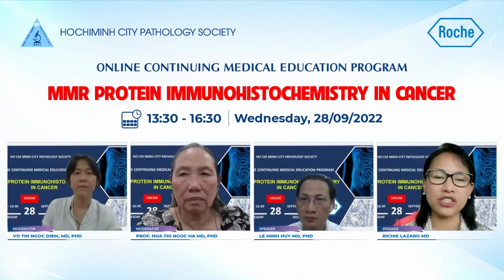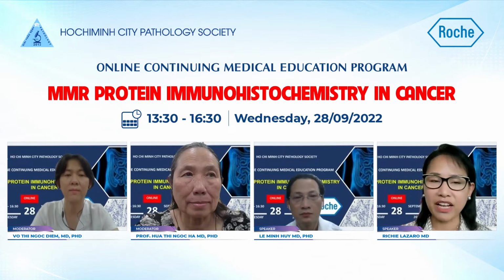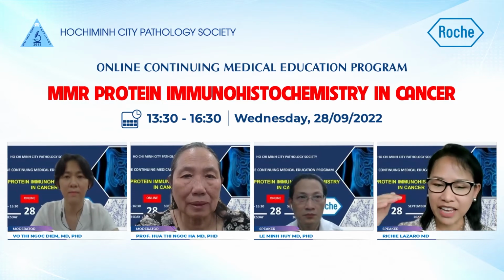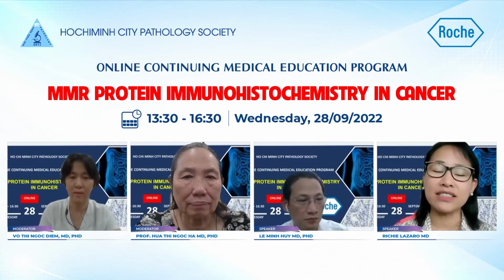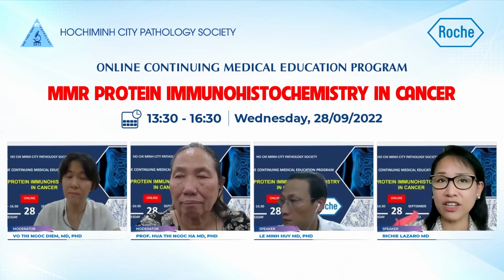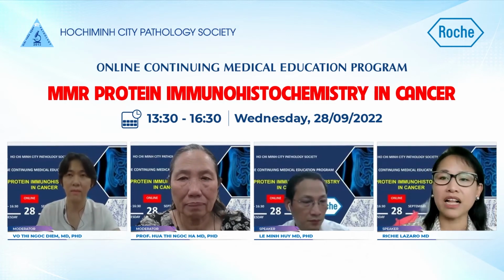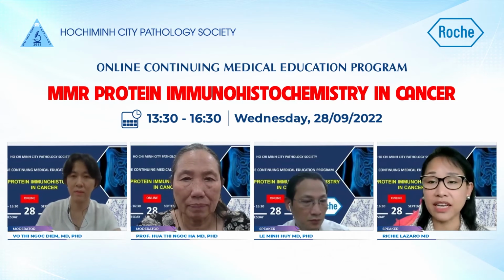Although in general, I guess what I'm saying is when it comes to MMR evaluation, the entire tissue can be evaluated in a proper context. But of course, when calling intact versus lost, it's the tumor itself, the neoplastic areas, and it will include invasive and in situ components.